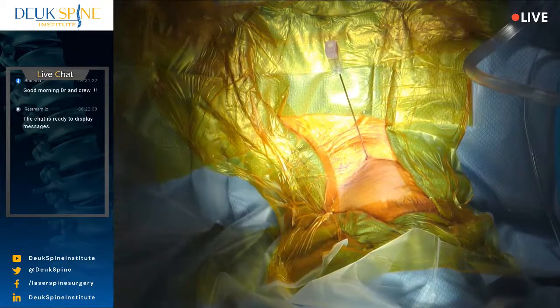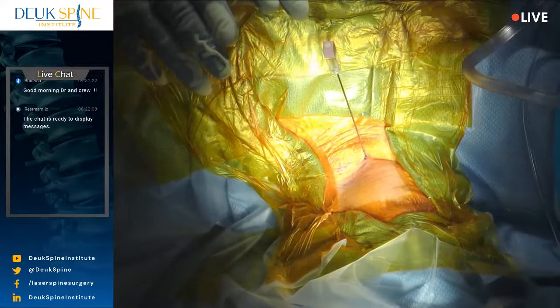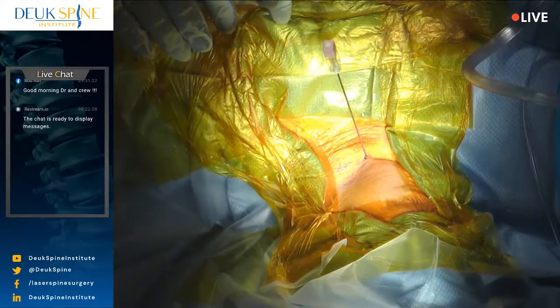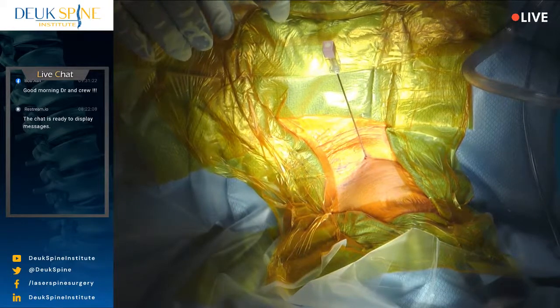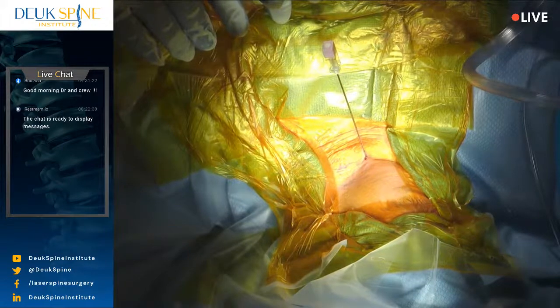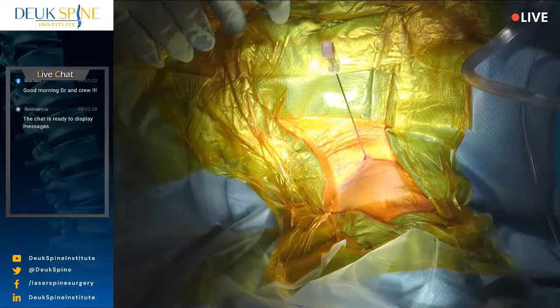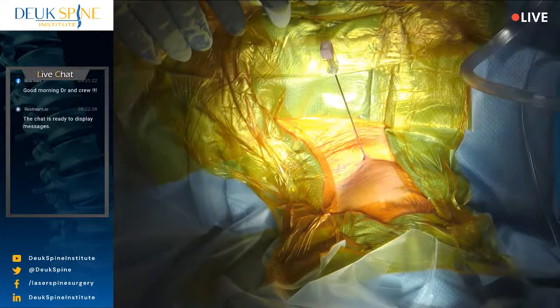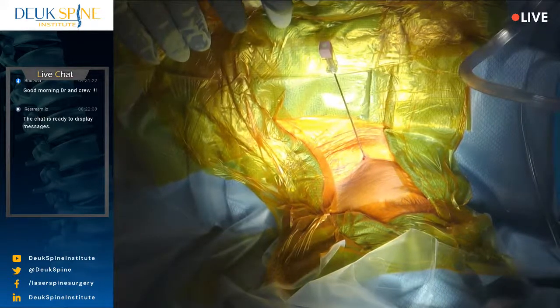Now I went right between two muscles in the front of the spine called the longus colli muscles. And if my fingers represent the longus colli muscles, there's a left and a right longus colli muscle. And go ahead and put something between my fingers, the dilator. So we went basically right into the spine, into the disc between those two muscles. You see that, Zach? Yeah.